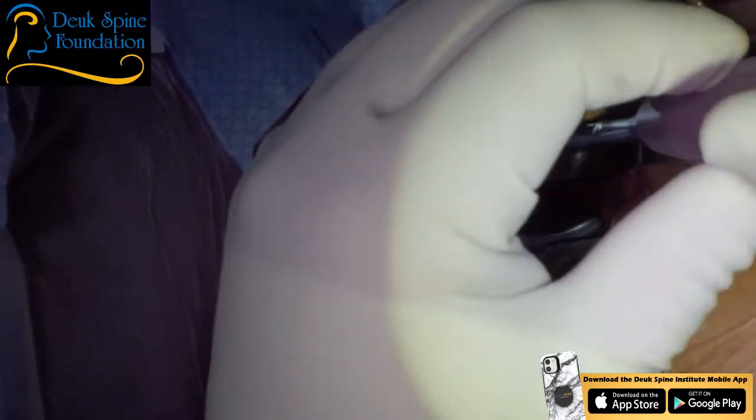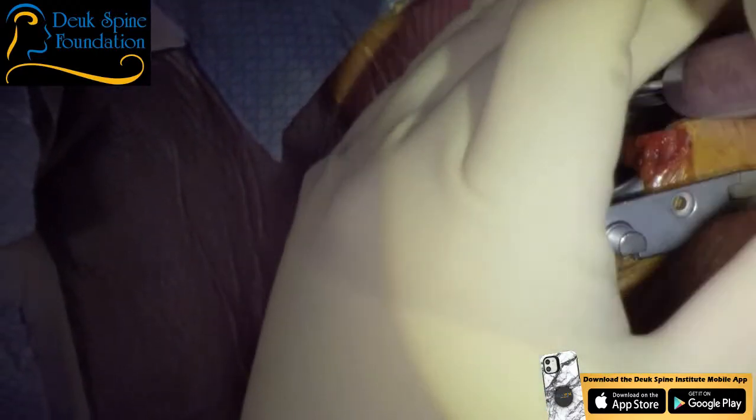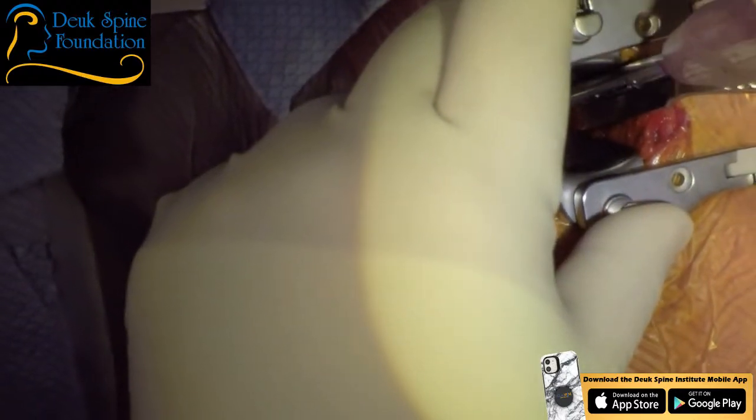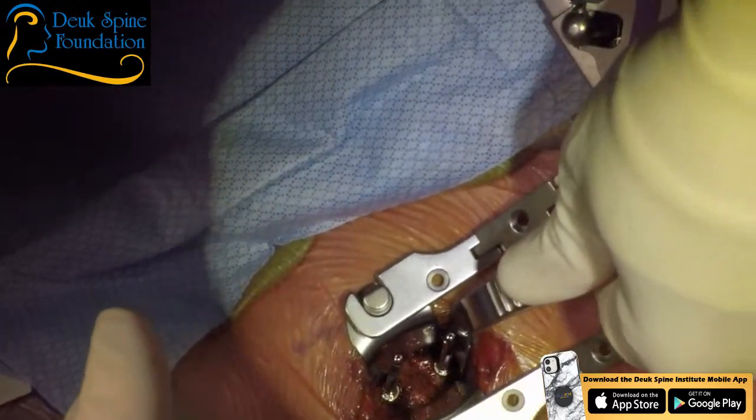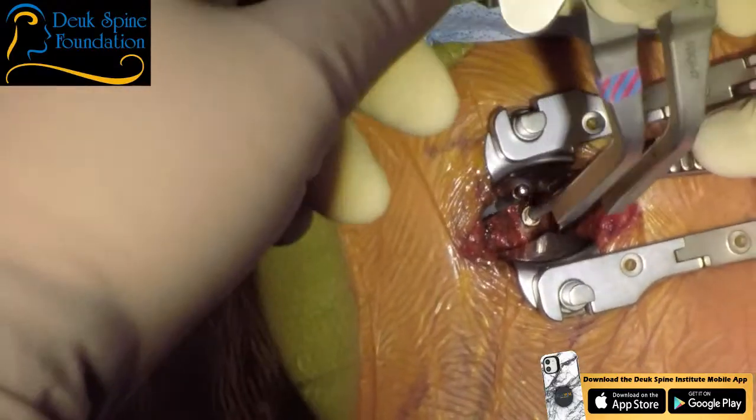We're going to do what's called parallel distraction of the disc space. It's a standard proper technique for ACDF. You're opening the disc space up so you can get the disc out. Don't put pressure on the post.